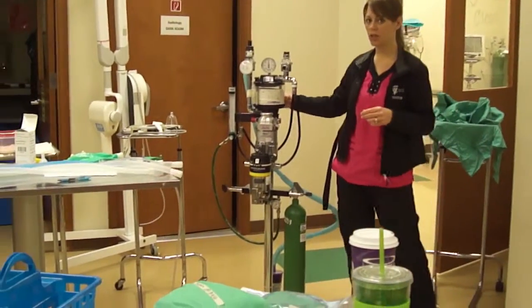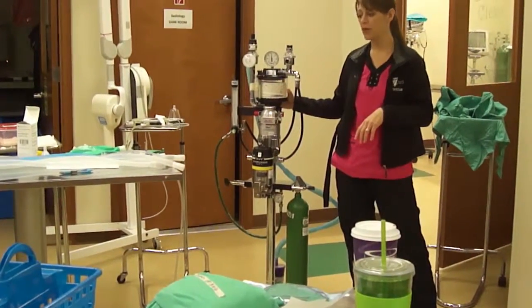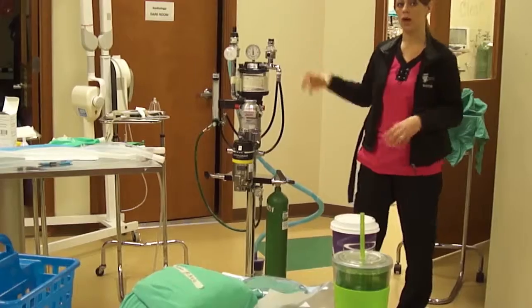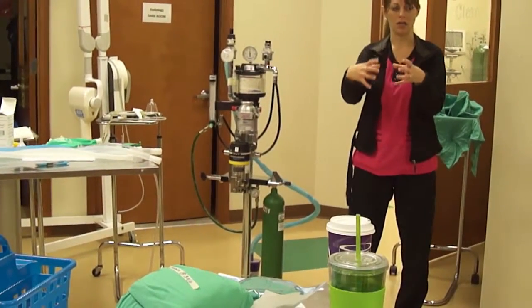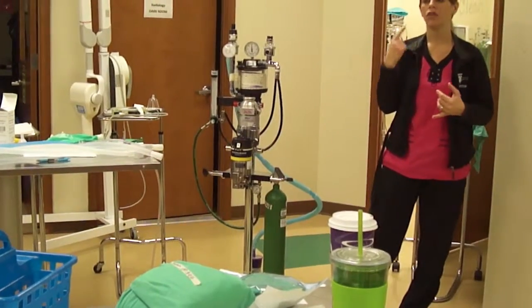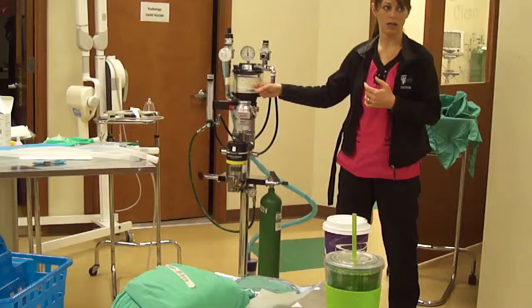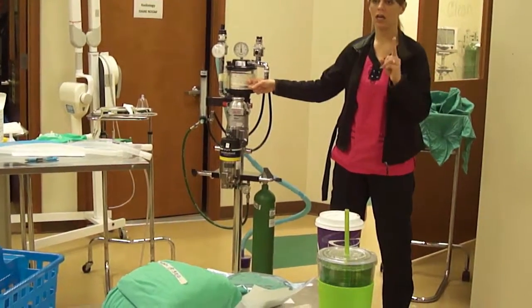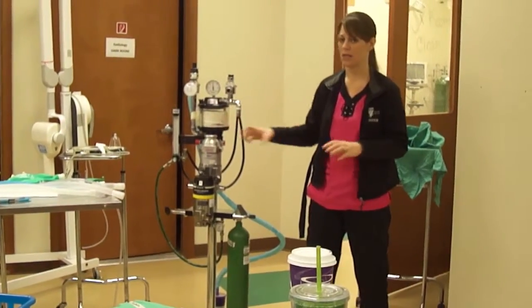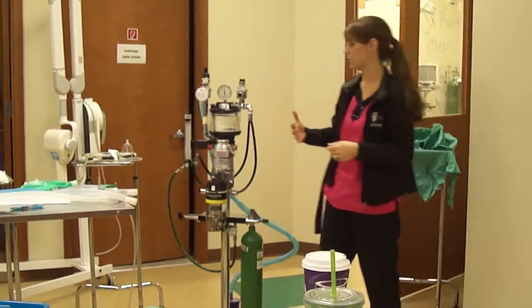To know how much this can withstand for time, when you empty this, you're going to weigh the empty container on the gram scale. You're going to fill it, and then weigh it again. Every kg of weight is equal to 8 hours of use time. That's of the granules, not the container itself, so subtract the weight of the container from the granules.